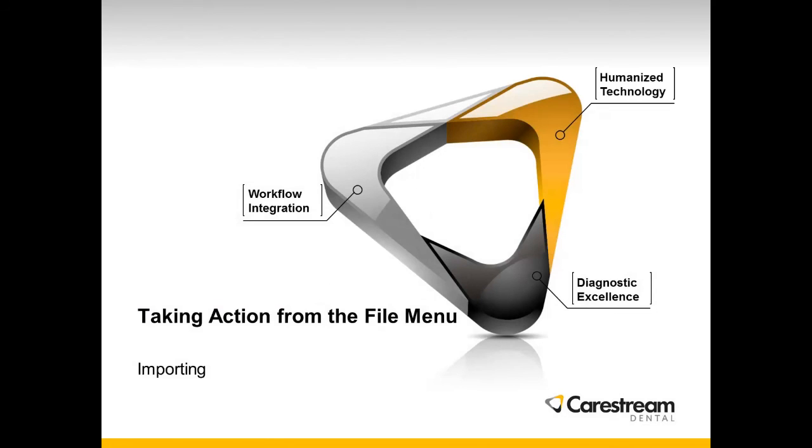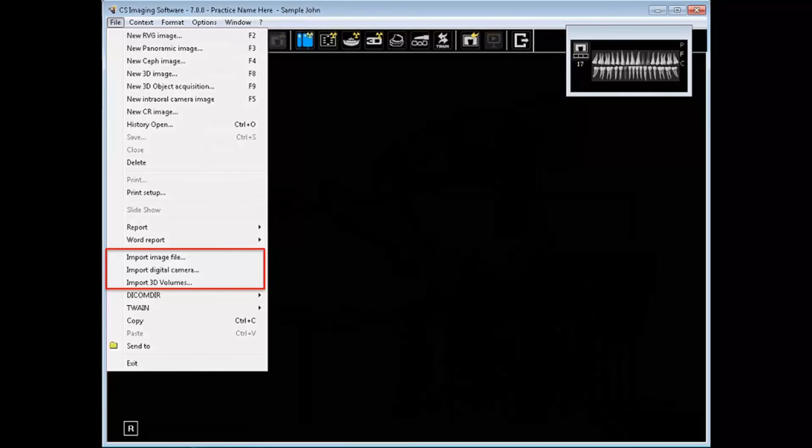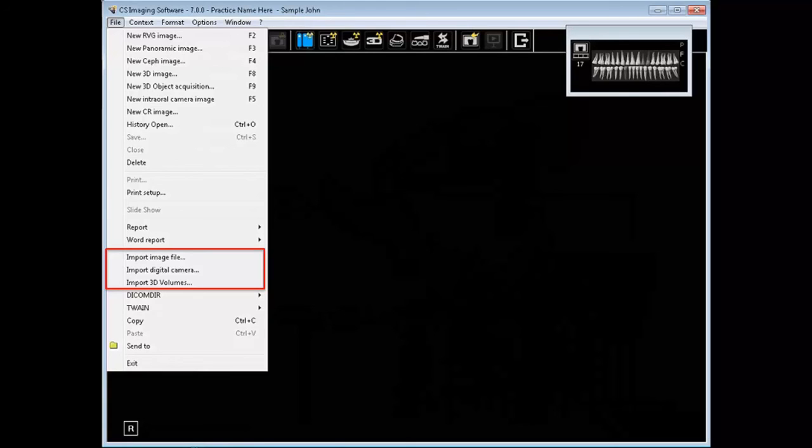Take action from the File menu Importing. To import one or more images from another directory or device such as a camera, follow these steps. File Import Image File, or File Import Digital Camera. You could also import 3D volumes.